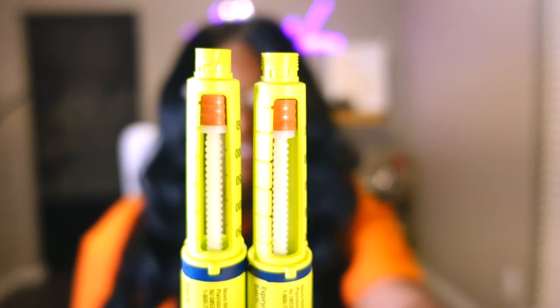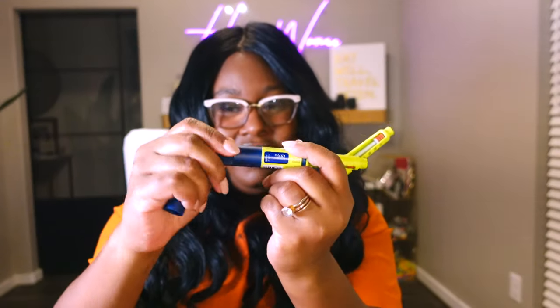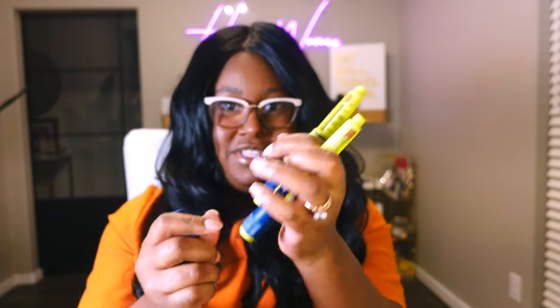So we have two insulin pens here. Both of them I want to show you are completely out of insulin — they are right at the end of their life. I could not twist anymore, couldn't use them anymore. Like nothing happens when you twist the ends of it. And so I found out that you can pull insulin from these pens.